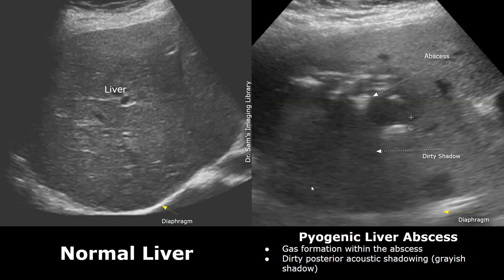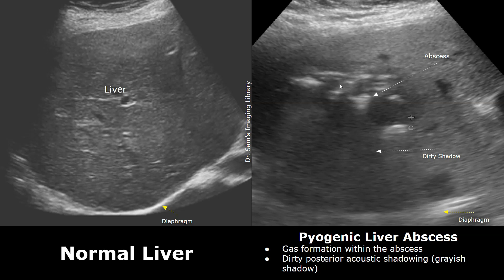A pyogenic abscess may also present with gas. A gas-filled abscess will show a hyperechoic area followed by dirty posterior acoustic shadowing. Dirty shadowing appears behind a gas-filled structure and this shadow will have a gray color. A clean shadow is seen behind very dense structures such as stones, and those shadows are completely black. This shadow is gray in color, so it tells us that it's behind a gas-filled structure.